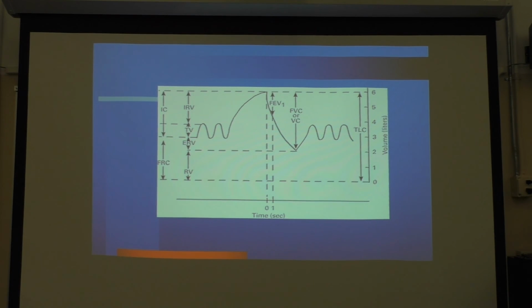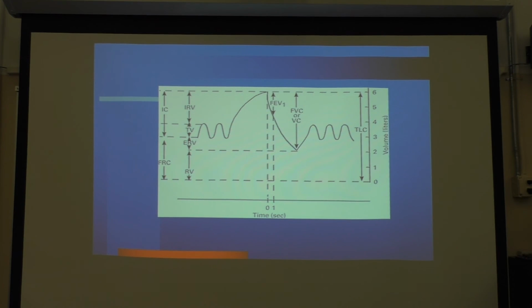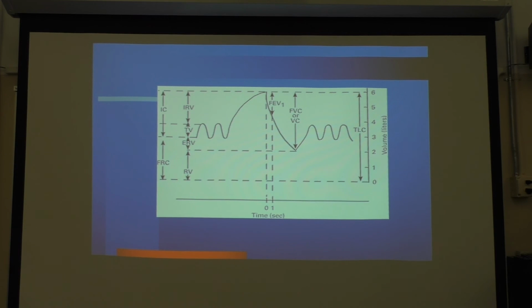And so they have expired their IRV, their tidal volume, and their ERV, which makes up their vital capacity, or in this case, forced vital capacity.